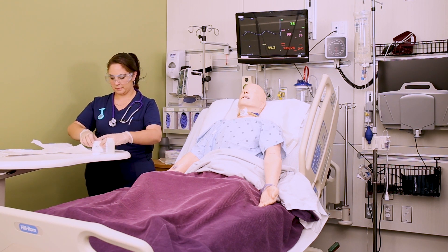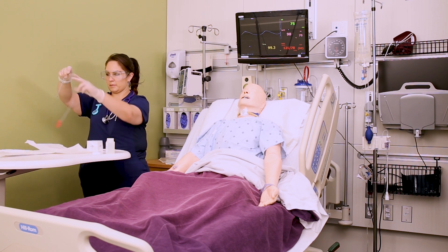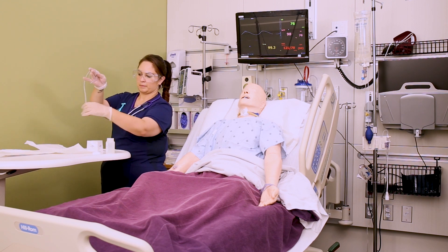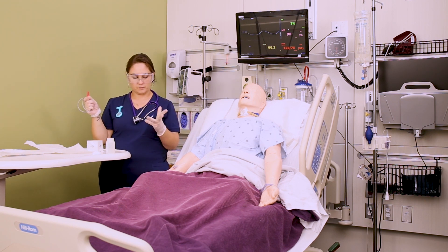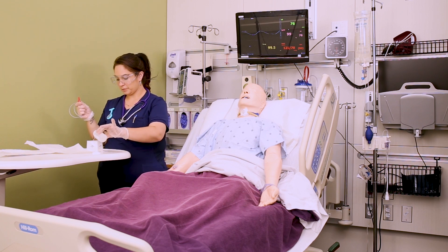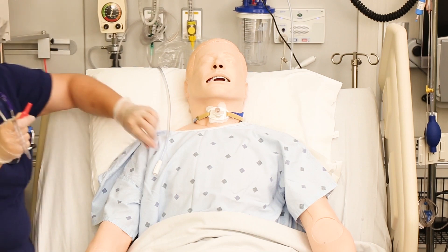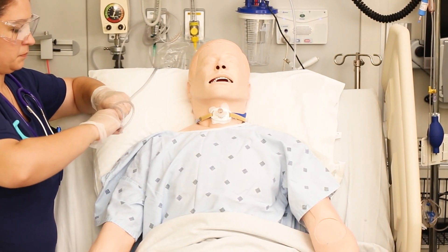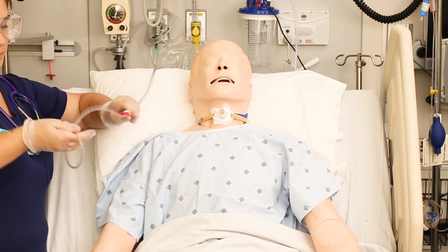Open your little cardboard water container and grab the suction catheter in your dominant hand, put the tip downwards, and wrap it around your hand. That way you can grab onto the plastic end of the suction canister. With your non-dominant hand grab the sterile water and pour some sterile water into the container — remember that hand is no longer sterile. Then grab the suction tubing and connect it to the plastic part of the suction catheter, being careful that only your sterile hand touches the catheter.